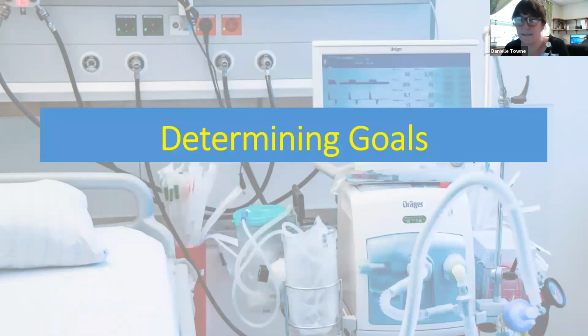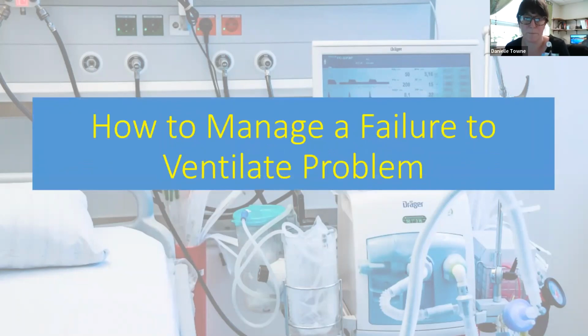All right, so how do we know what settings are actually best to use? We talked about all the different aspects of it, right? But how do we actually know where to start or what to set people at? The first thing that we need to do is determine our goal and determine if our patient is in a failure to ventilate situation or a failure to oxygenate situation. And then from there, we can figure out what the goal is.